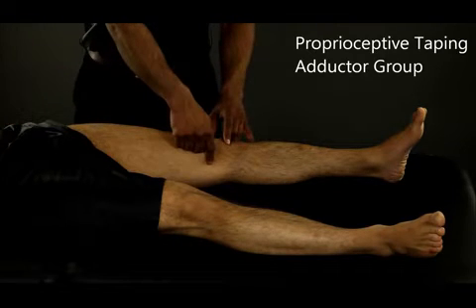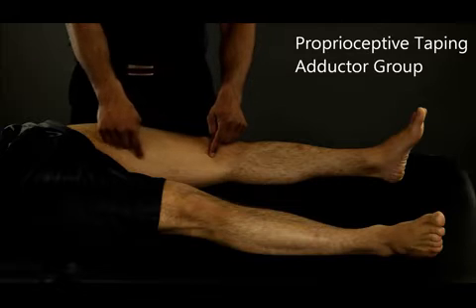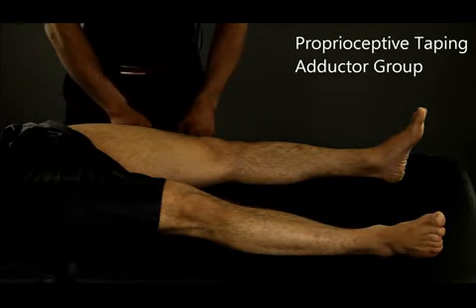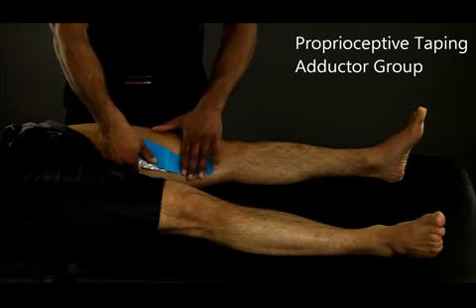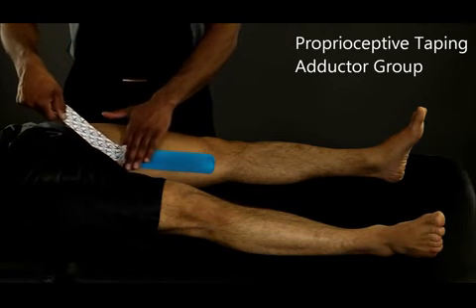Start by placing the tape at the distal end, or insertion, taping along the fibers of the muscle towards the proximal end, or origin. Be sure that the tape does not stretch out.